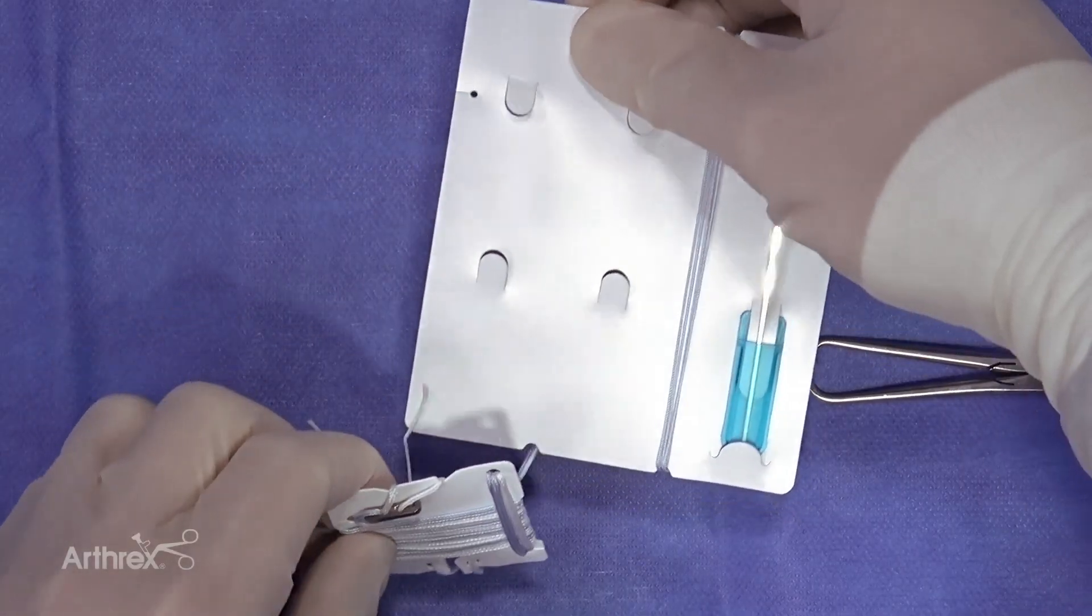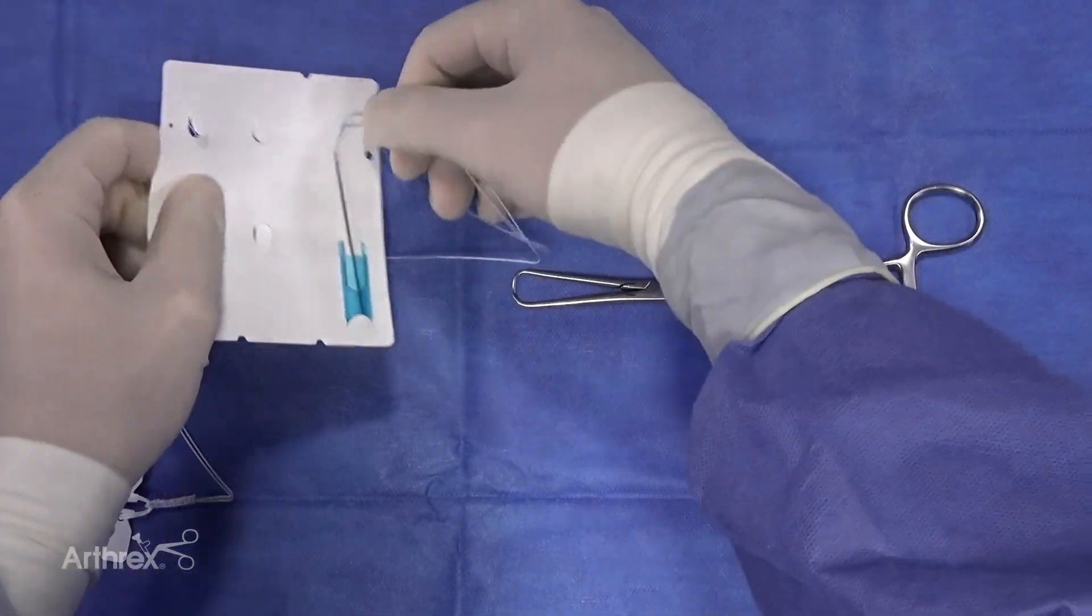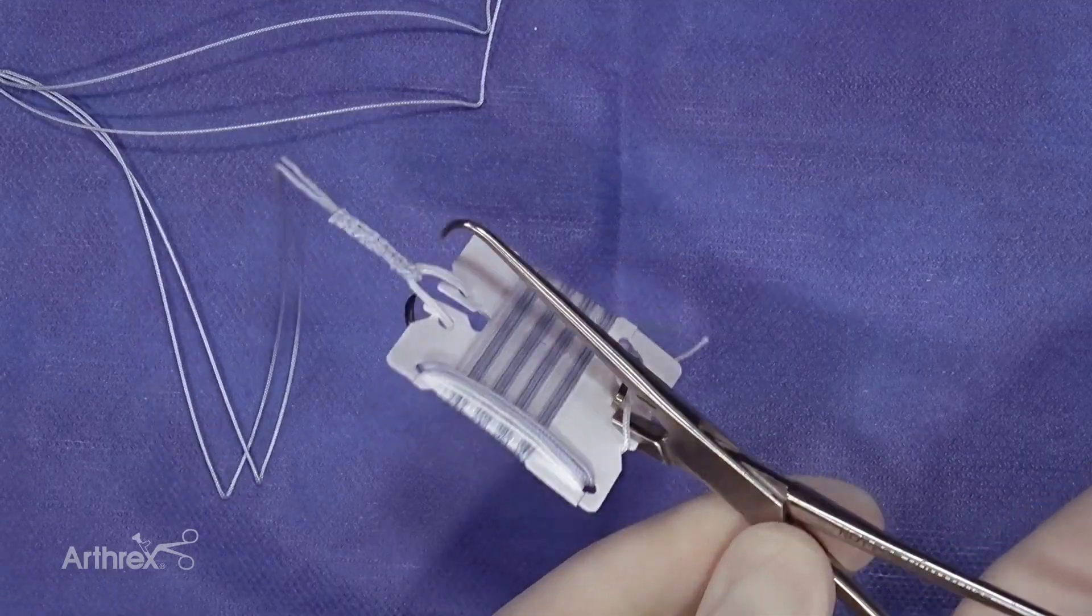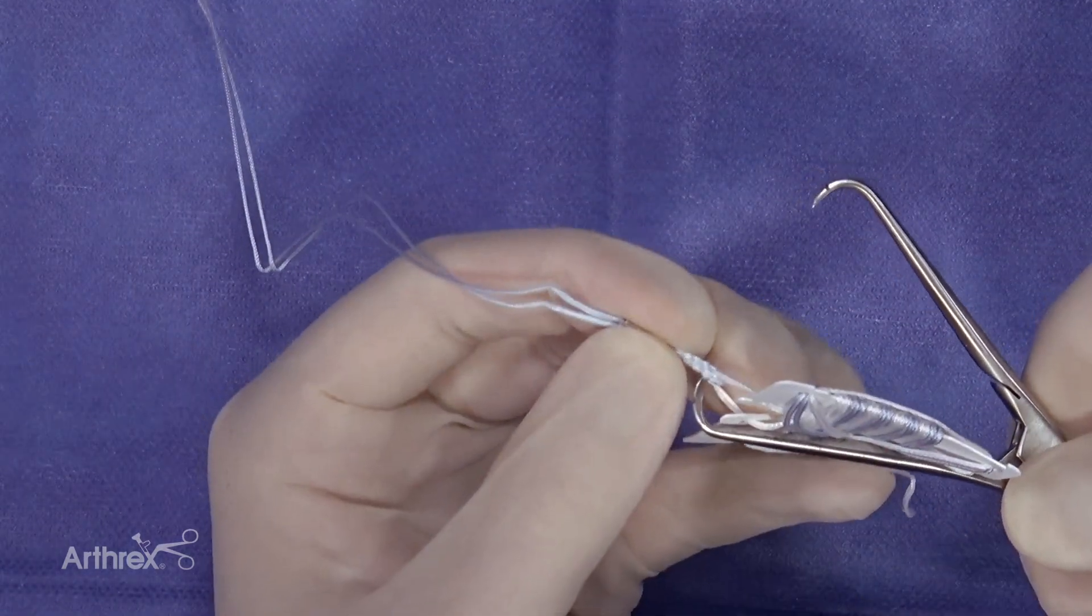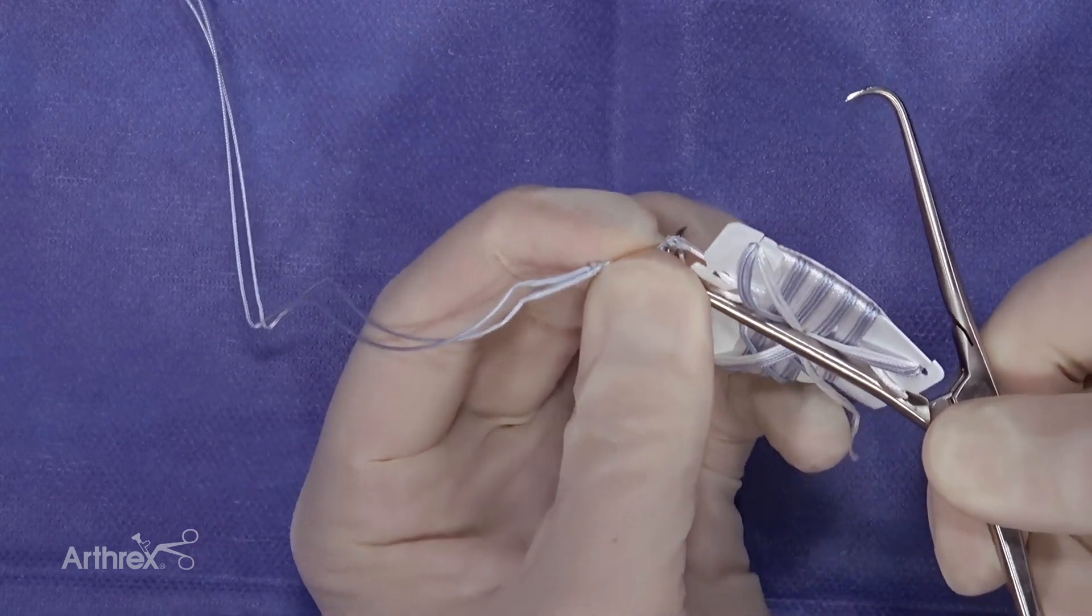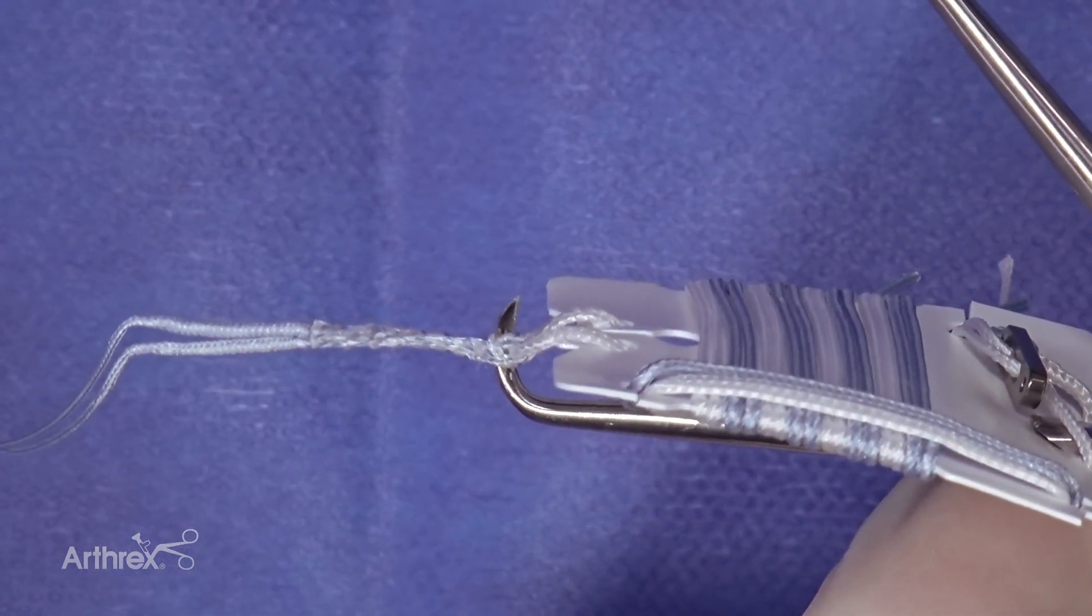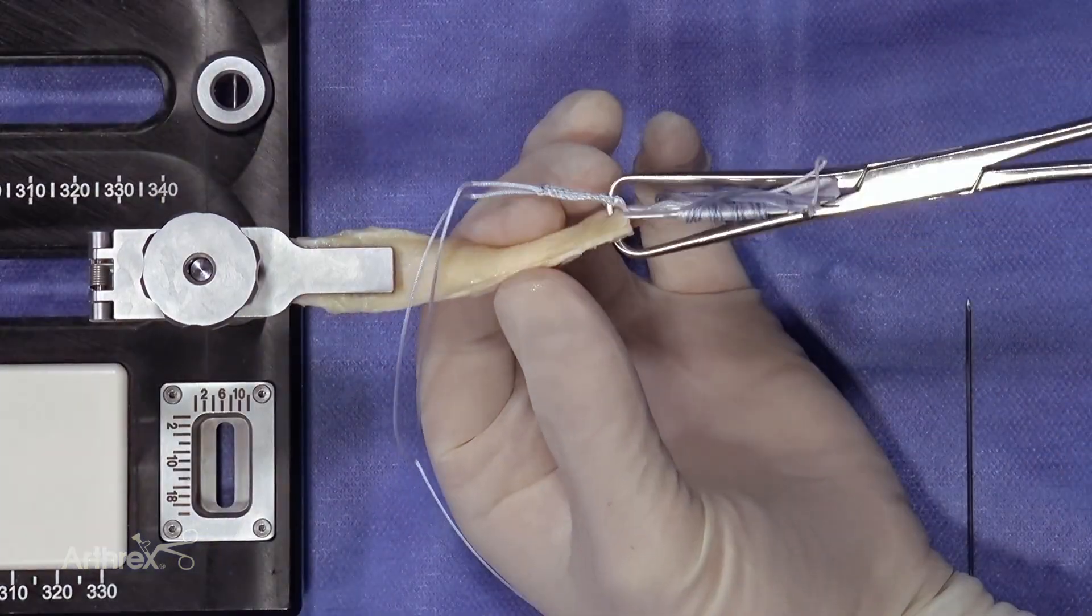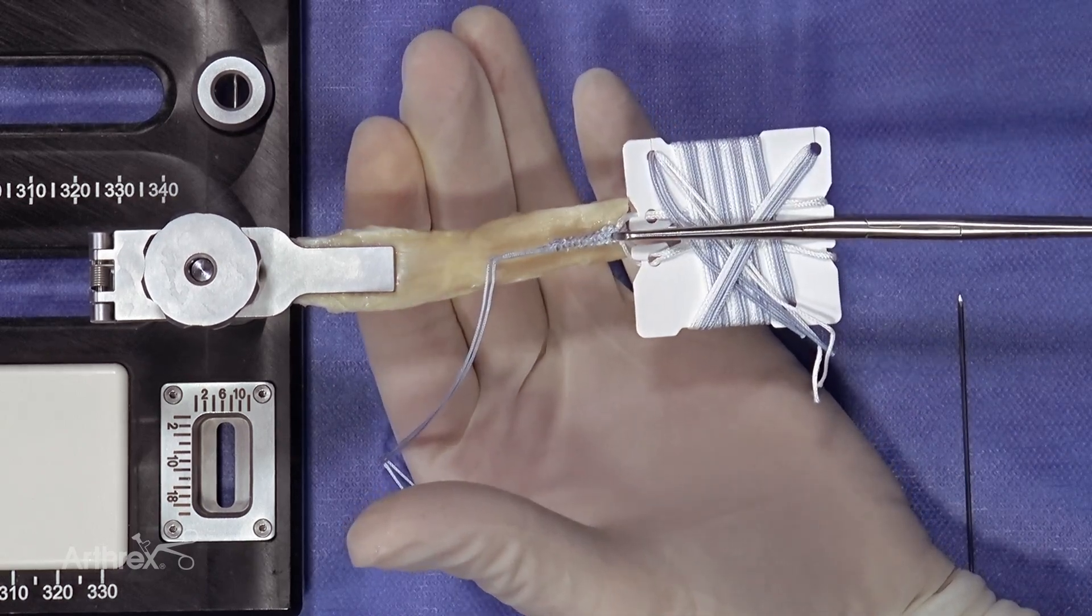We can slide it into the clamp and then we'll take the sharp tip of it. You can see the length is perfect and it could pierce the end of the fiber tag that's hooked onto the tightrope loop. This will hit in that notch so it doesn't move and it's locked in place. We then place this on the graft about two to three millimeters from the end and it pierces and holds it very well.